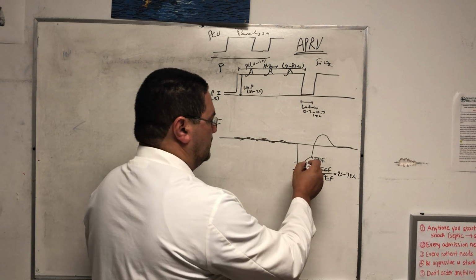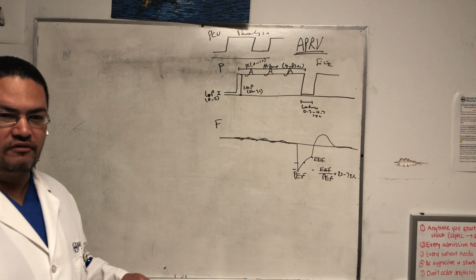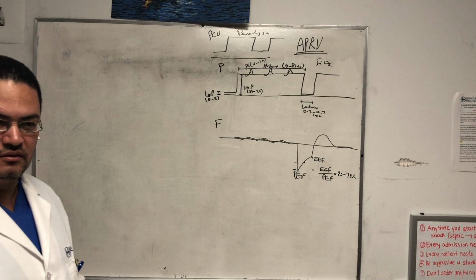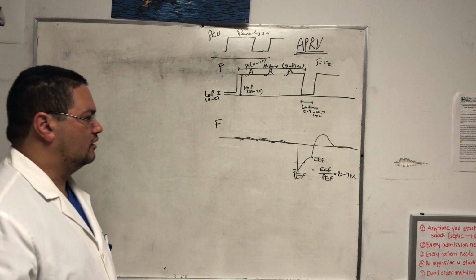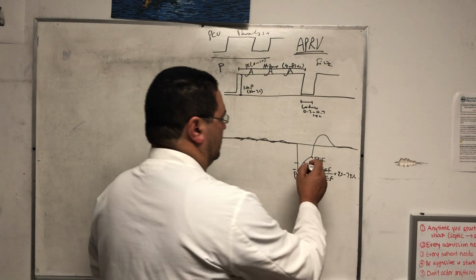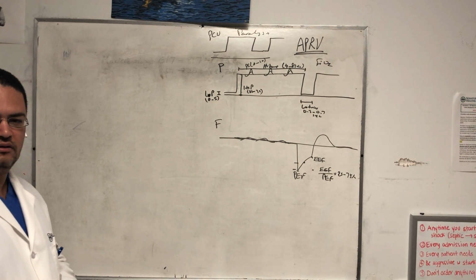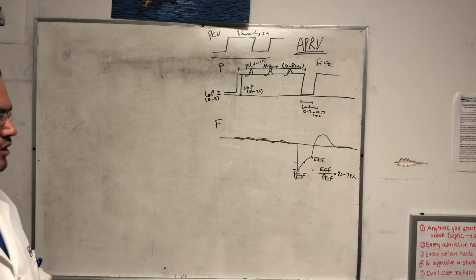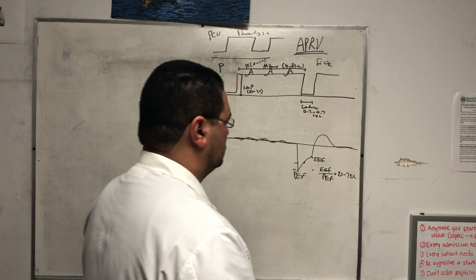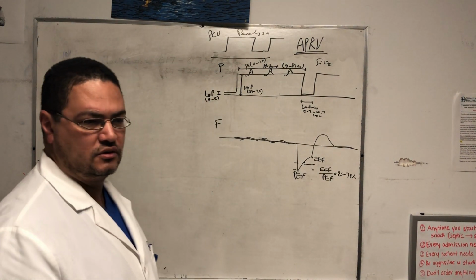So that means the patient is gonna have extra auto peep, and the patient might pop his lung, right? So what do we do for that? Extend the low time. You have to increase the low time. We'll make the low time a little bit longer, and then that will improve the patient's condition.